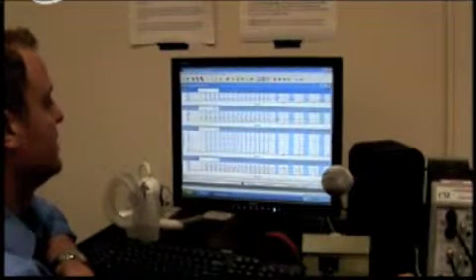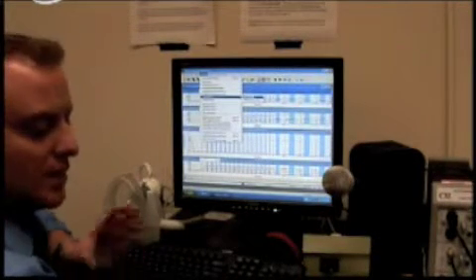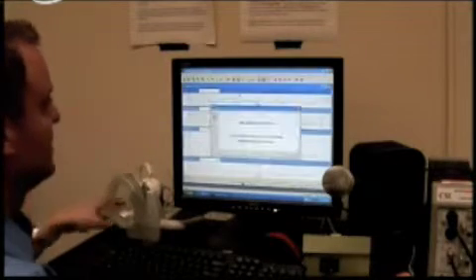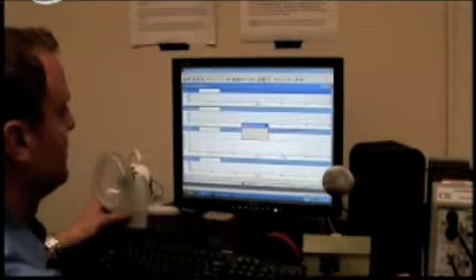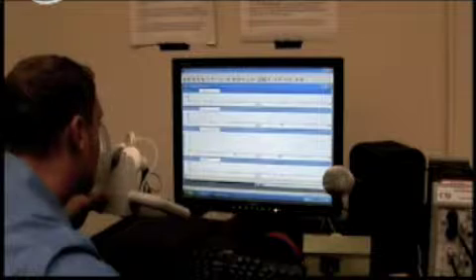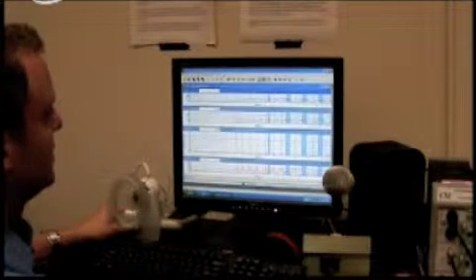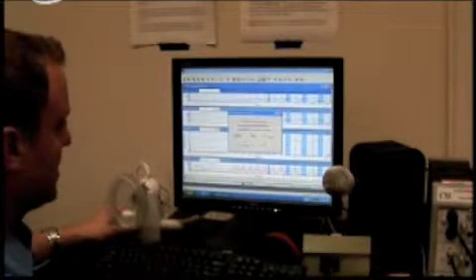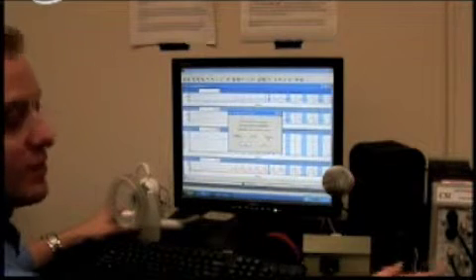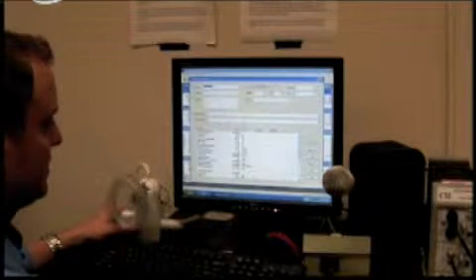Where this is a bit different than the CSL is if we did another protocol here — you can do multiple protocols and it'll add to the existing statistical data. So we're going to do a voicing efficiency. Pop, pop, pop, pop, pop, pop, pop, pop, pop. So we get there, do our threshold, hit our statistical results, and it'll ask you if you want to replace these results, append them, or make an average of them. This is a good tool for if you're doing multiple passes. We're going to append them just so I can show you how that looks. So you have voicing efficiency one and two.